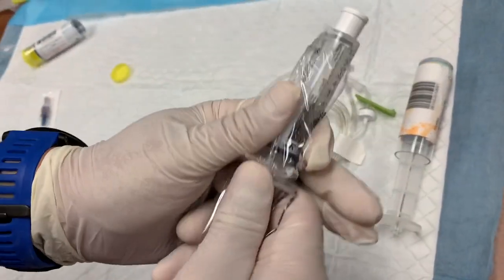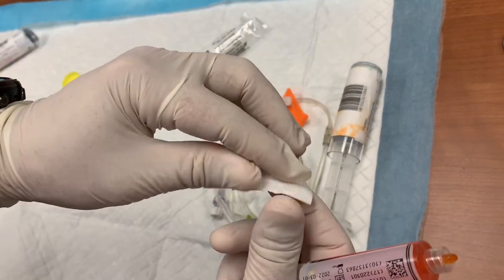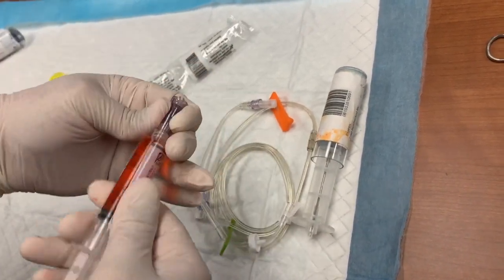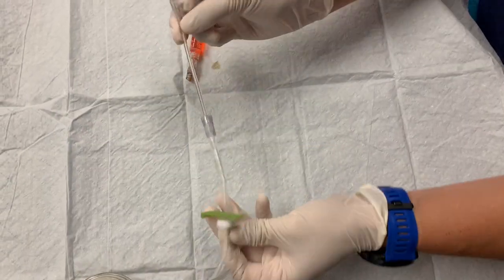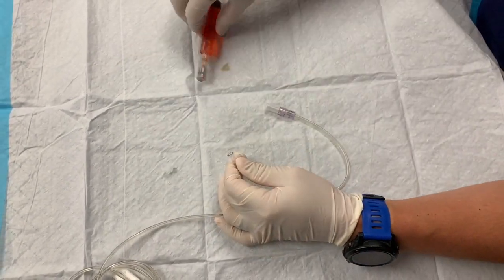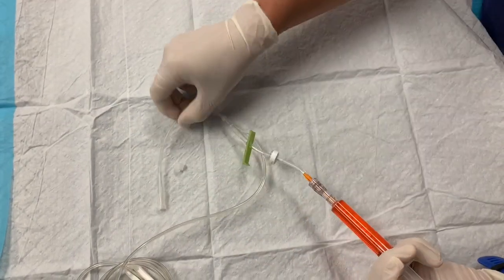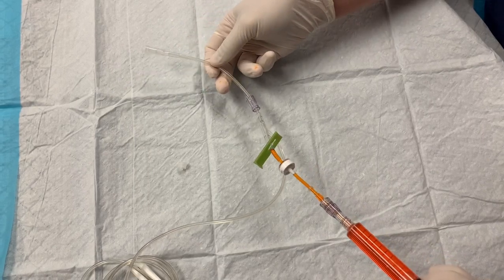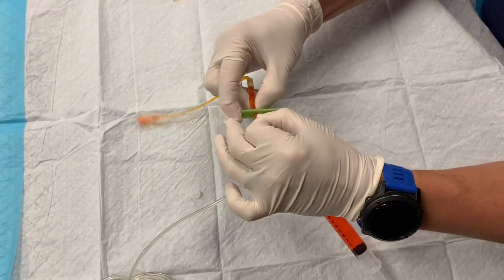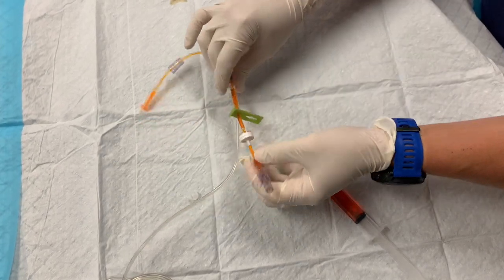Next, grab your saline flush — for this demonstration we're going to trade that out with something colored orange — and use your needless port adapter. Attach that to the end of your flush and give that a quick prime to get all the air out. Your IV kit has a Y port with a pigtail attached. The pigtail doesn't currently have a port, so screw the needless port adapter onto the end and prime the pigtail down to the patient end of the tube with your saline. Once finished, make sure you clamp it off, and when you detach your saline, leave that port adapter on the end of your line.